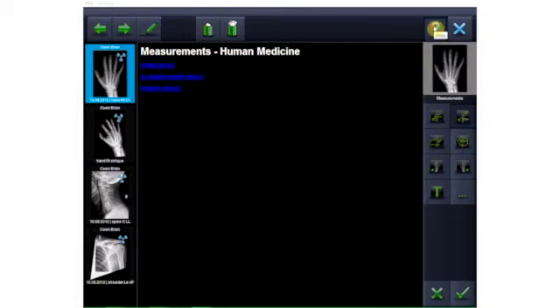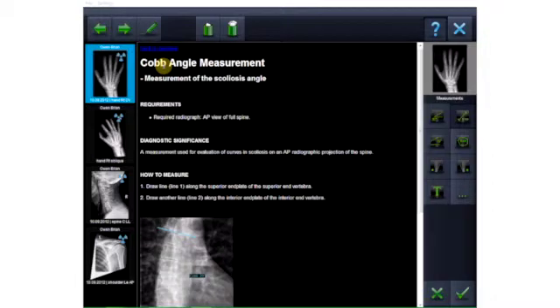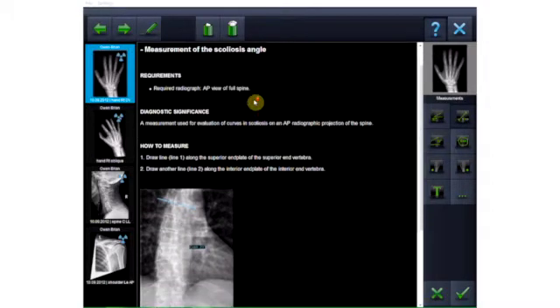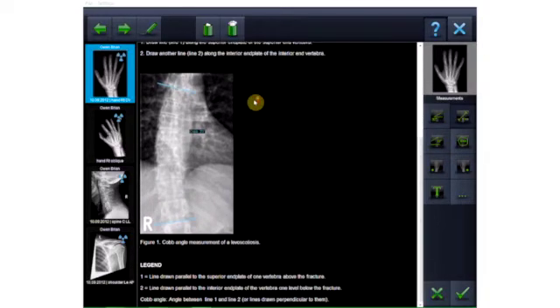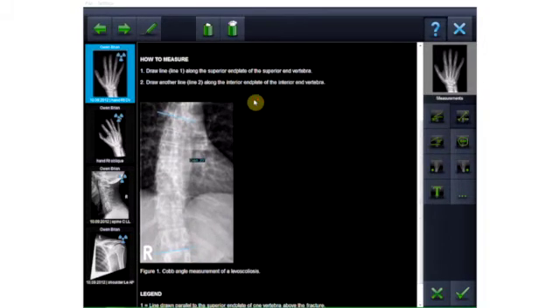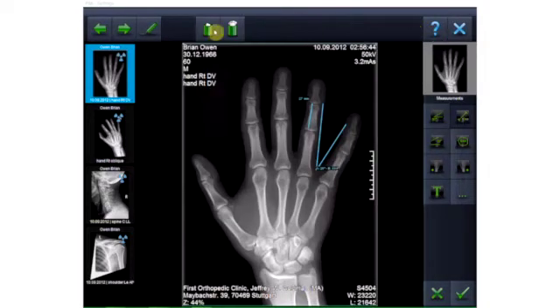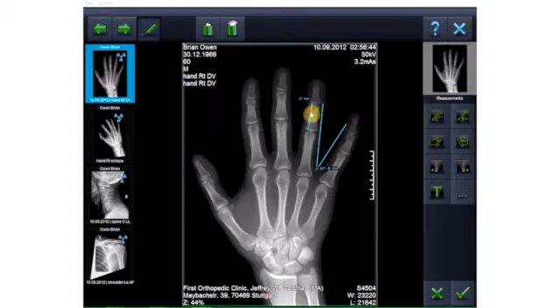Online help is available to support you in performing special measurement functions such as the Cobb angle, Ullmann Sharp angle, and Wieberg angle. All measurements and objects can be edited — that is, moved or deleted.